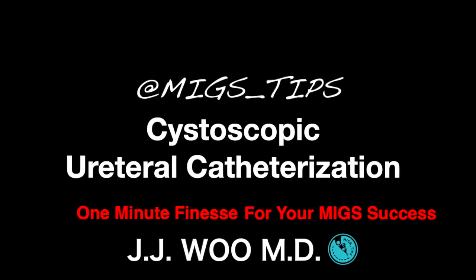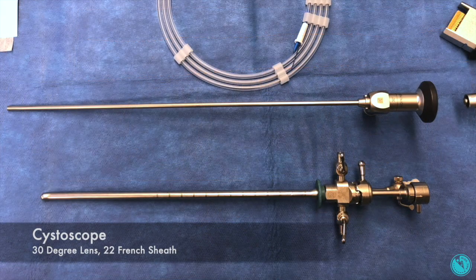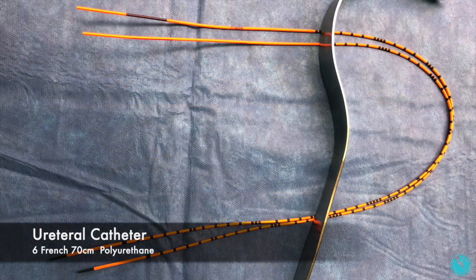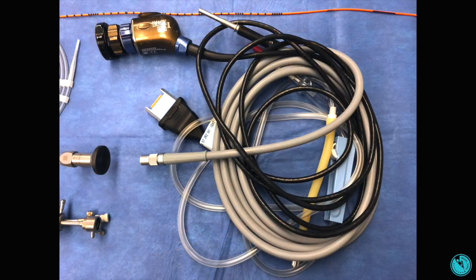Cystoscopic ureteral catheterization. For this demonstration we use a 30 degree lens, 22 French sheath, 6 French 70 cm polyurethane ureteral catheter, and standard camera and light source.